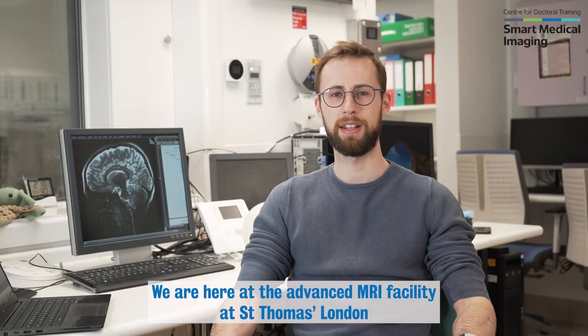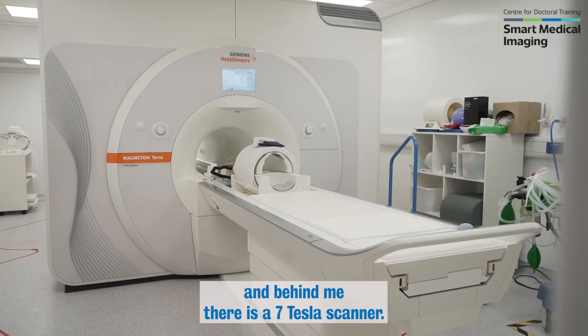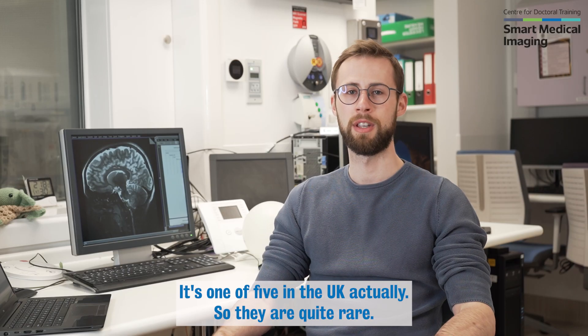We are here at the Advanced MRI Facility in St. Thomas', London, and behind me there is a seven Tesla scanner. It's one of five in the UK, actually. So they are quite rare.